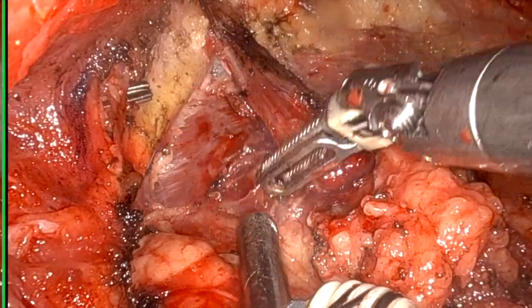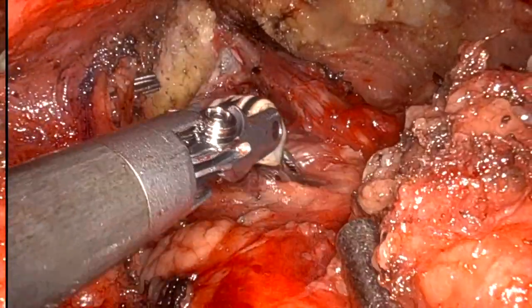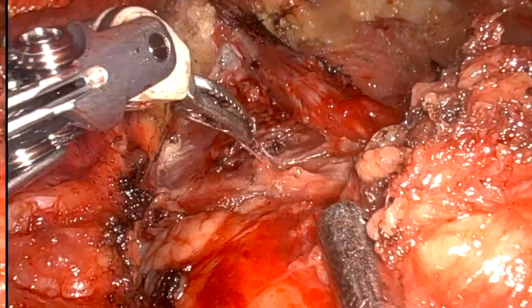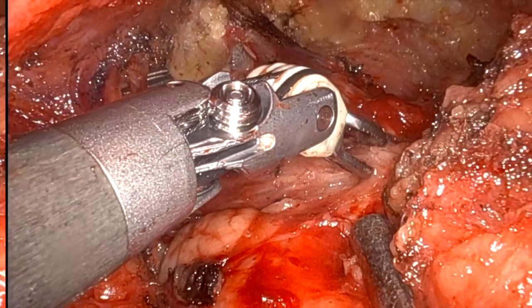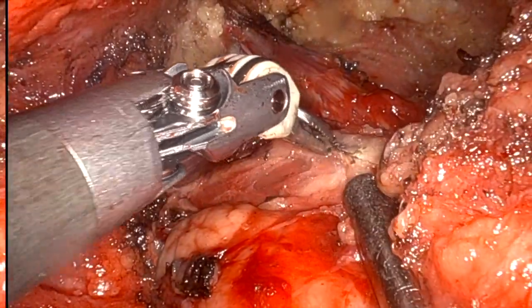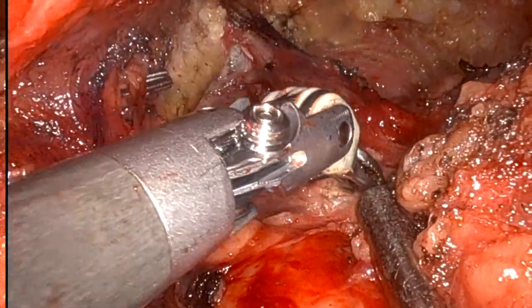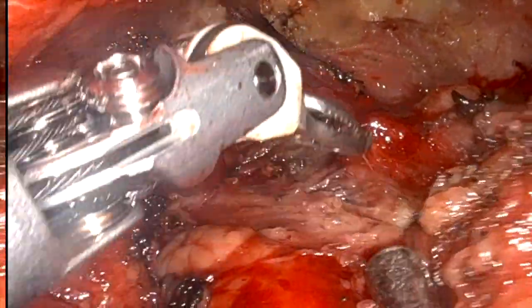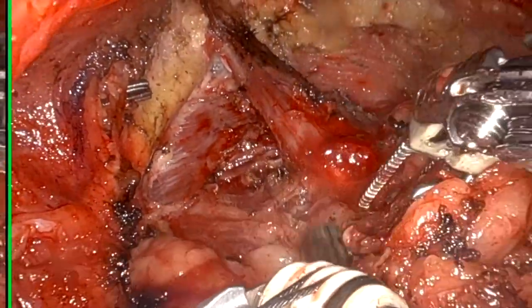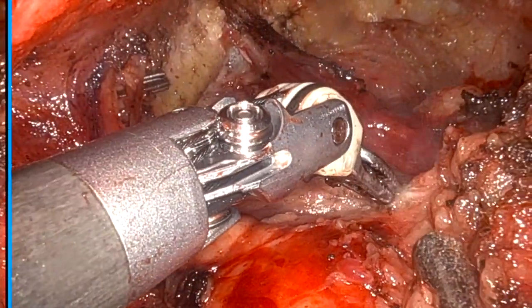What do we do in open surgery? Just clean the lower border of the mylohyoid muscle, poke the finger in and then put the retractor. And you can see everything: hypoglossal nerve, duct, lingual nerve. But here we cannot do this. So here we need to pull the tissue from the mylohyoid muscle very gently, everything under vision, because the hypoglossal nerve is there and you cannot afford injury to the hypoglossal nerve.